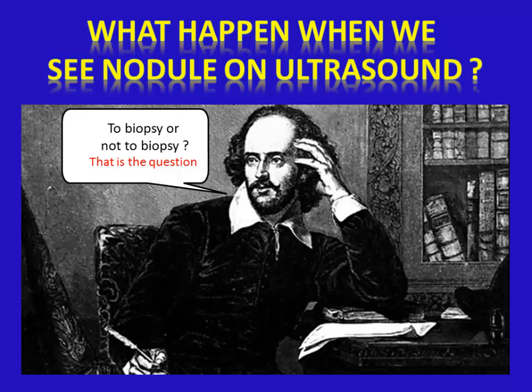what will happen after we do the ultrasound, the most important question that will come to our mind is to take a biopsy or not to take a biopsy. And actually, in order to answer this question, we have to keep in mind many factors, including the risk factors the patient is exposed to, like radiation during childhood, positive family history of thyroid cancer or multiple endocrine neoplasia, also the sonographic assessment of this nodule, and the least is the size of this nodule.